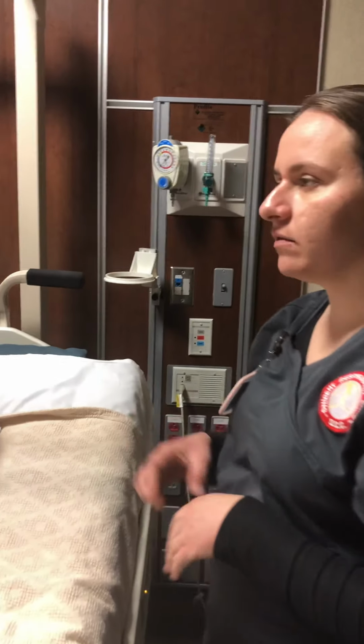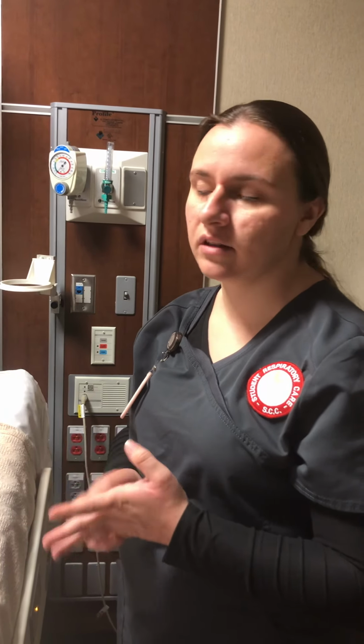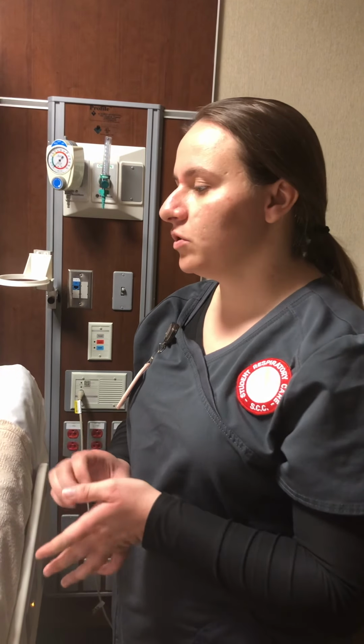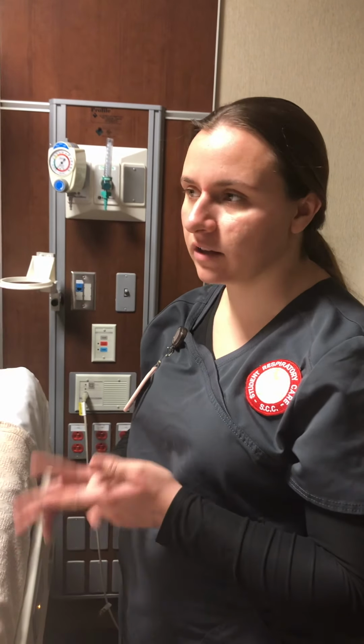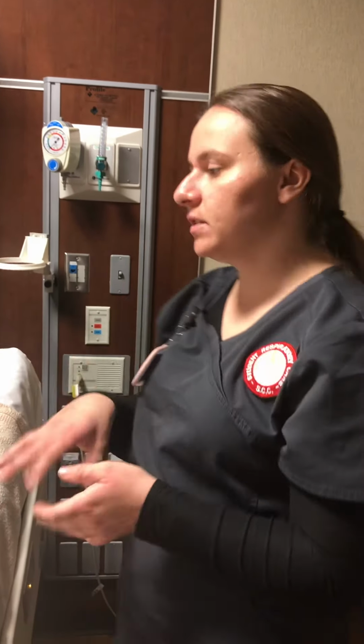So after I change a device, I always need to double check and check the patient's vital signs and listen to their lungs, make sure they sound okay. And especially after operation, always check to make sure the lungs don't get any atelectasis, anything like that. So when I'm done, I wash my hands. I'd always come back and check on them. And I'm going to chart on the patient's chart and talk with the doctor to let them know that I changed them to a face tent. That way it helps them, especially after them having nasal surgery.